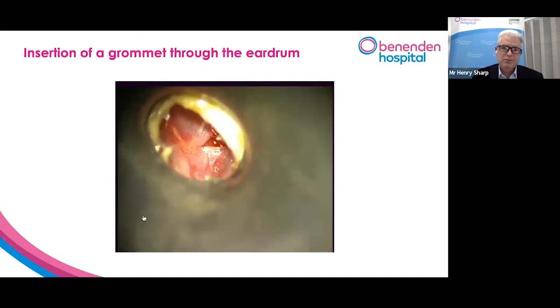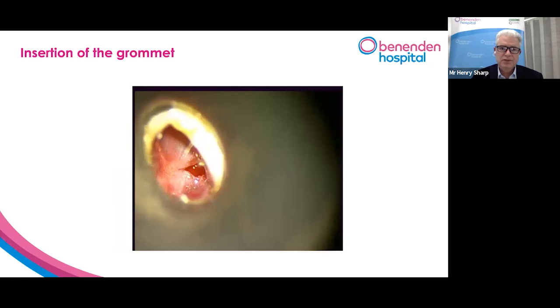So we make the hole and we actually remove the mucus at that same time. And you can see the sort of yellow mucus in the middle ear as it comes out. Then we put in the grommet, which is this tiny little drainage tube. It looks like a tiny little cotton reel with a little hole down the middle.